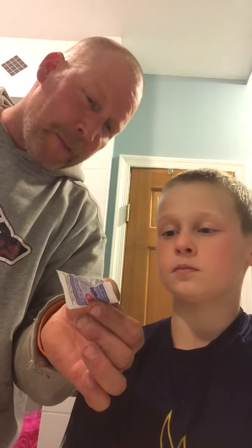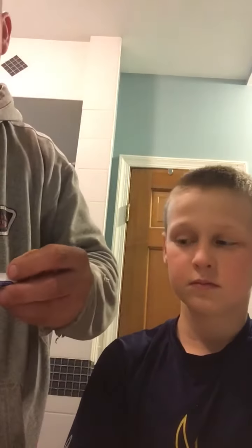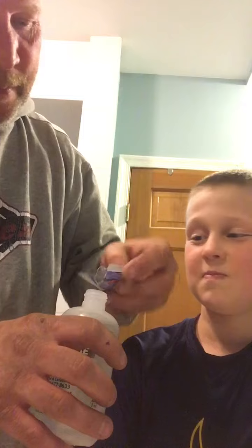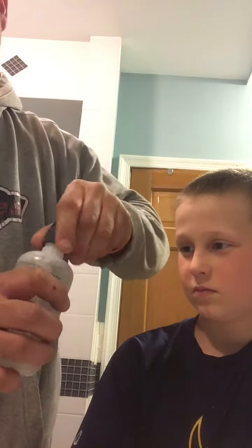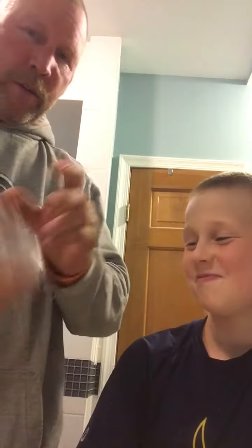It's a salt rinse that's pH balanced for your body, so when you put the water in your nose it doesn't burn. We fill this bottle up with warm water, just so it's the same temperature as your body. It doesn't burn — it's smooth. Then we shake it up.